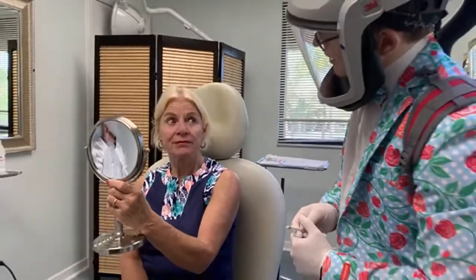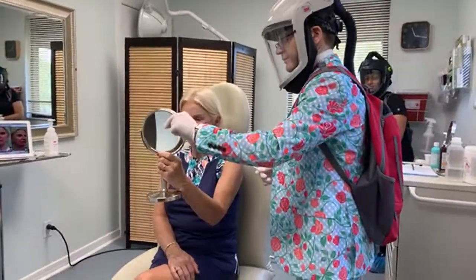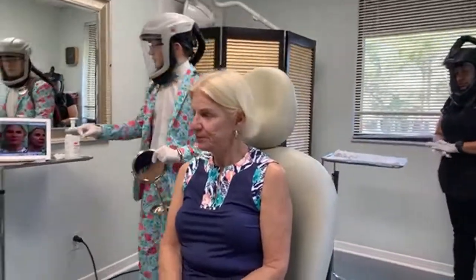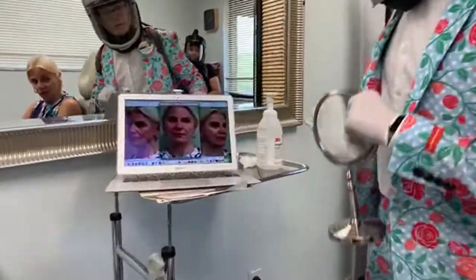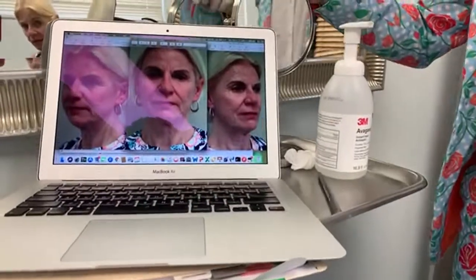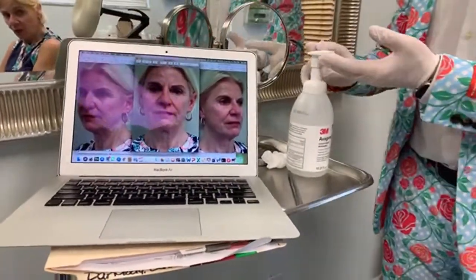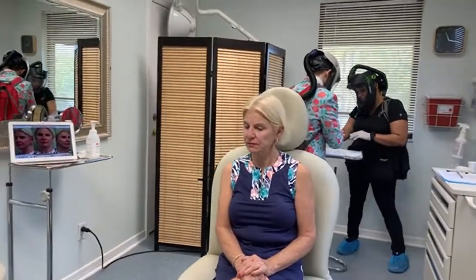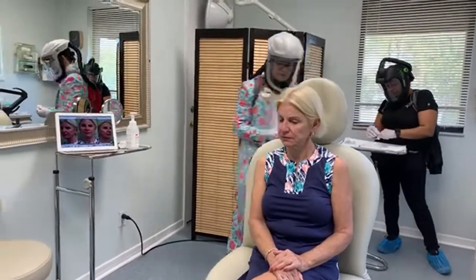Okay, any questions about our goals? No. Okay, very good. I'll hold this for you. And you can see we've got her pictures over here. So these are the before pictures, and then of course we'll compare those to the afters. For the physicians and students that are watching, I like to use the Hibiclens cleanse and the alcohol swab. Can you open that for me, please? For cleansing on the skin.